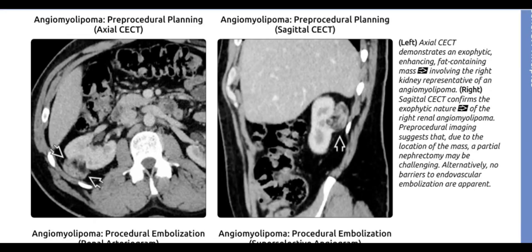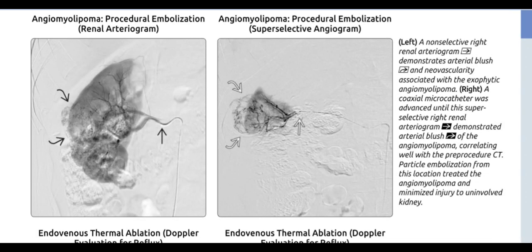Axial CECT demonstrates an exophytic enhancing fat-containing mass involving the right kidney, representative of an angiomyolipoma; sagittal CECT confirms its exophytic nature. Pre-procedural imaging suggests that due to the location of the mass, a partial nephrectomy may be challenging; alternatively, no barriers to endovascular embolization are apparent. A non-selective right renal arteriogram demonstrates arterial blush and neovascularity associated with the exophytic angiomyolipoma. A coaxial microcatheter was advanced until a superselective right renal arteriogram demonstrated arterial blush of the angiomyolipoma, correlating well with the preprocedure CT; particle embolization from this location treated the angiomyolipoma and minimized injury to the uninvolved kidney.